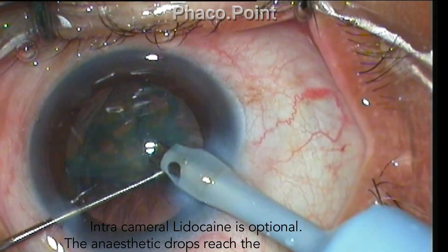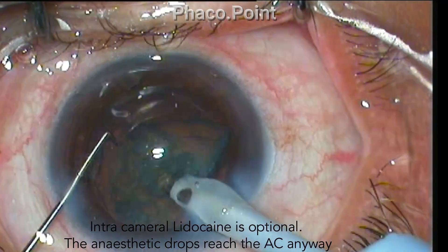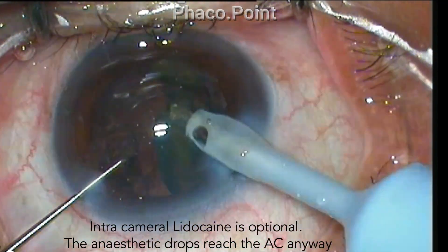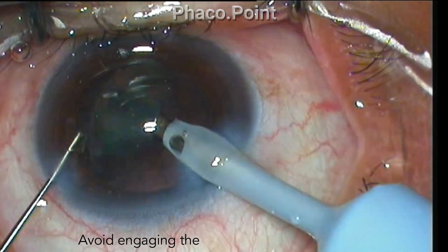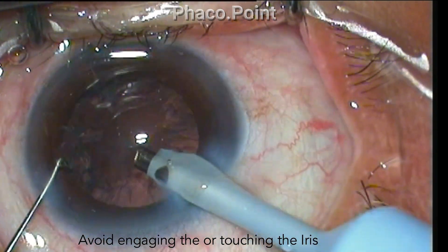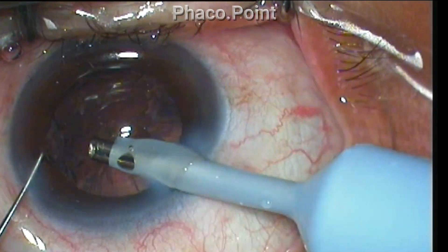Intracameral lidocaine is optional; however, I do not use it routinely, because proparacaine passes transcorneally and transclerally to anesthetize the iris. You should avoid engaging or touching the iris.